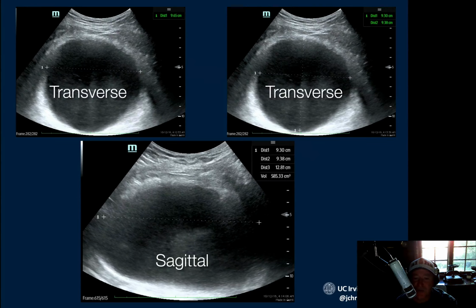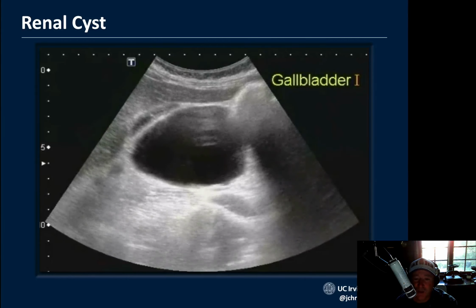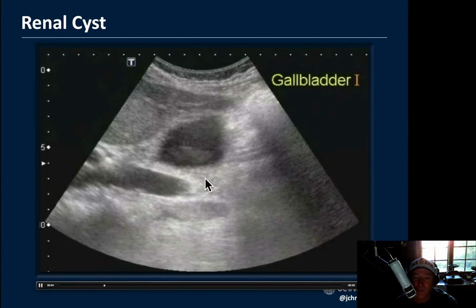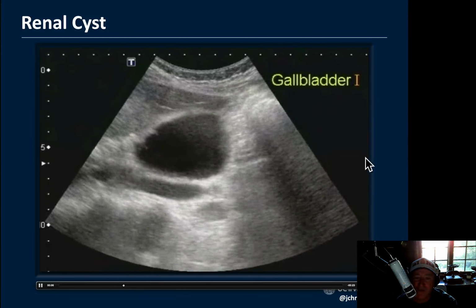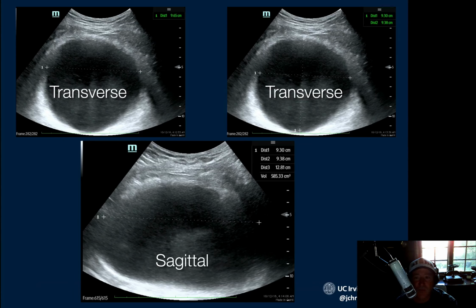What's in the differential diagnosis when you have a dilated structure here? Obviously, you put the probe down, depending on what the probe is, you're thinking AAA. This could be the gallbladder. This could be something in the ovary that came all the way up in the upper abdomen. So just keep that in mind. It could always be a few different things.